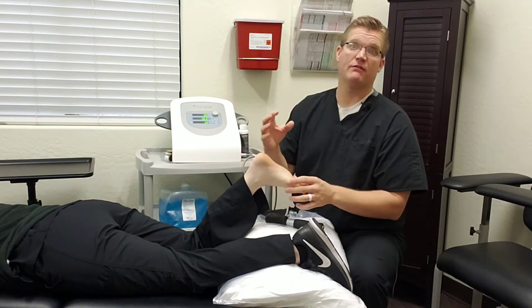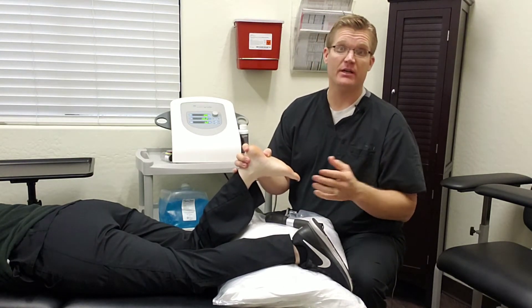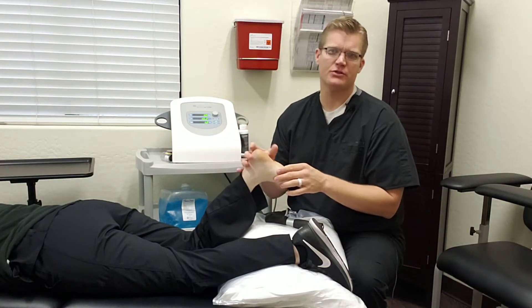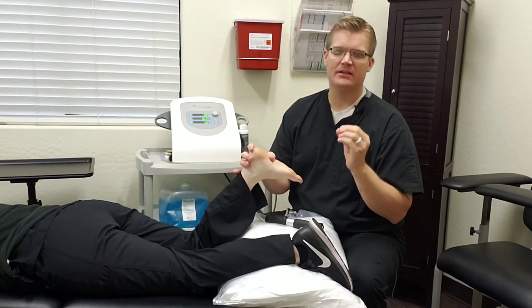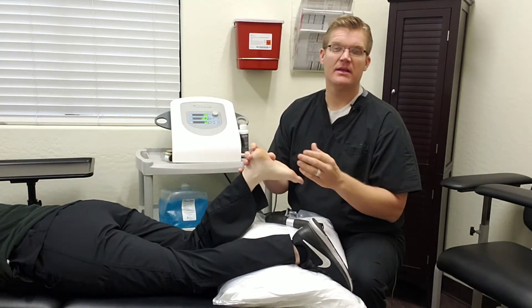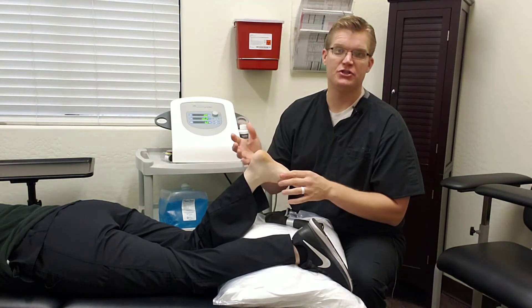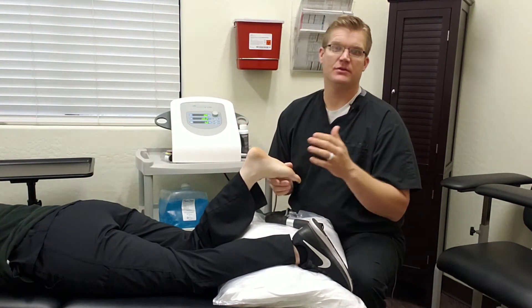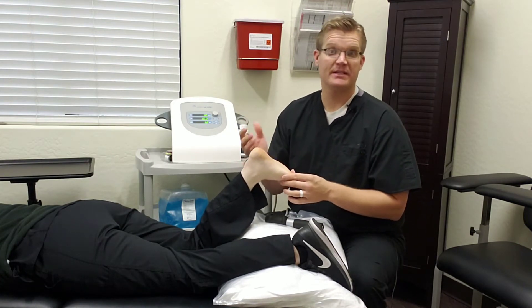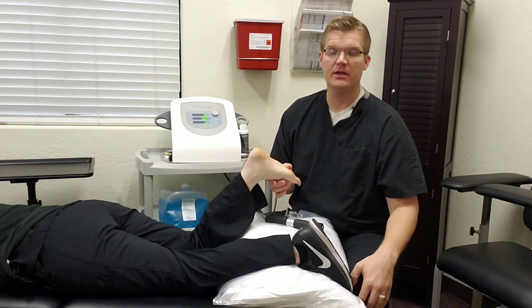Radial pressure wave therapy is great for both of these regions, but it's also very effective for other areas like golfer's elbow, tennis elbow, frozen shoulder, patellar tendon issues such as knee problems, IT band issues, and things like that. It works very effectively, so if you've ever experienced jumper's knee, or maybe as a youth you had that pain right below your knee, this treatment can help.